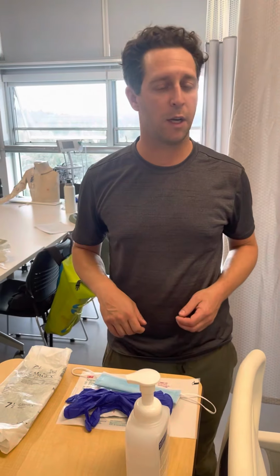This is my 3-4-2 video for a CVAD dressing change. I've identified that the patient needs a routine dressing change Q7 days, even though the dressing is dry and intact.